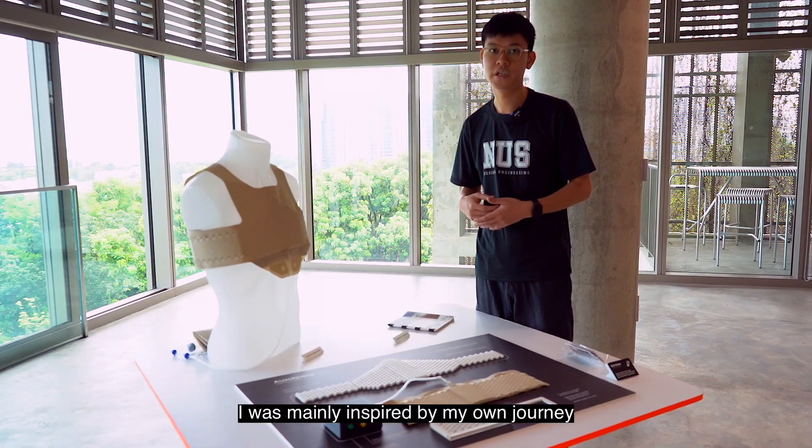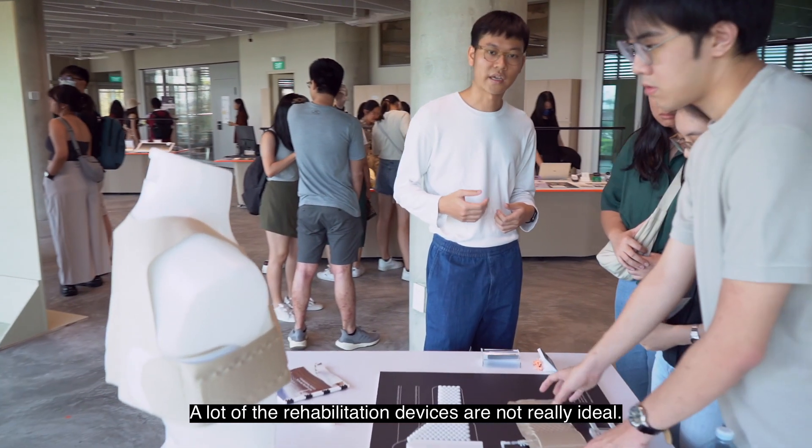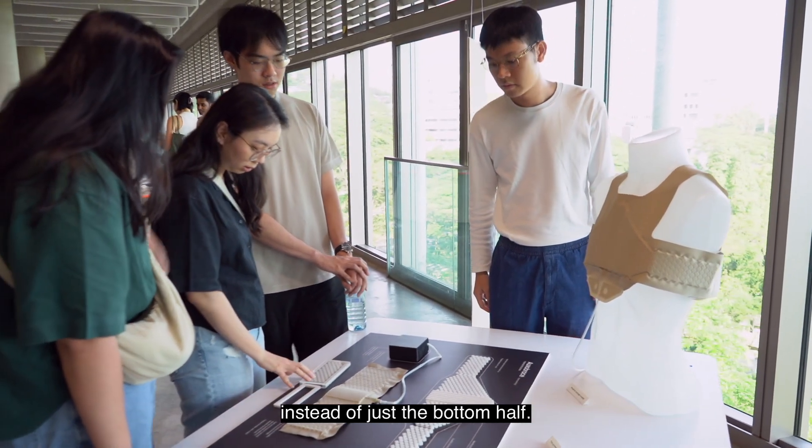I was mainly inspired by my own journey through recovering from open-heart surgery two years back. A lot of the rehabilitation devices are not really ideal, which is why I wanted to create one that could support the entire sternum instead of just the bottom half.